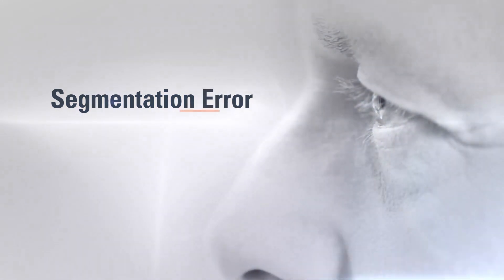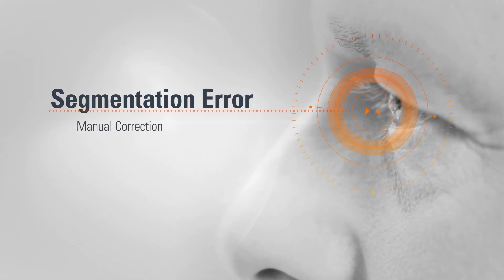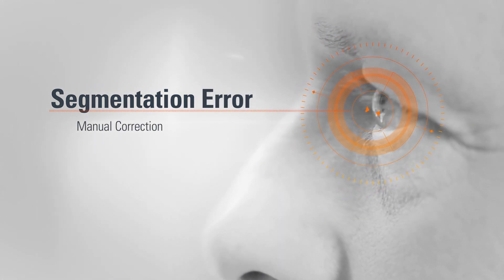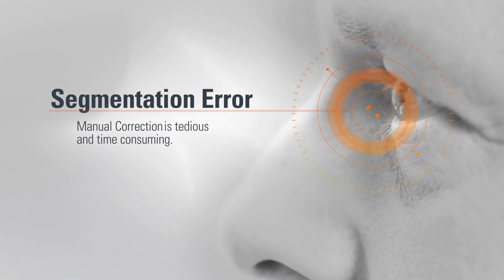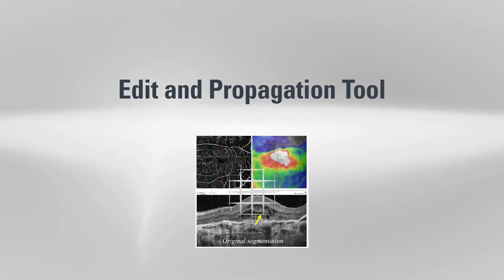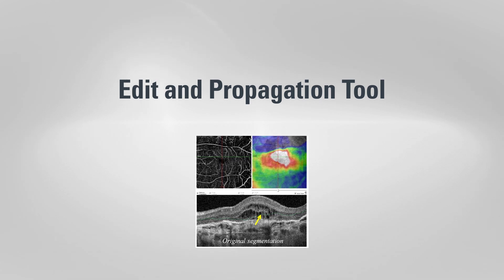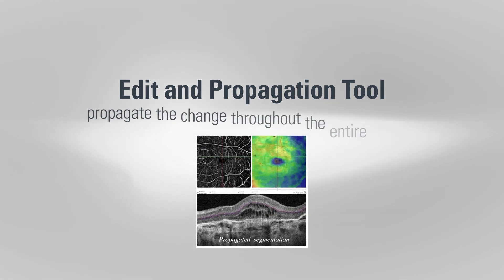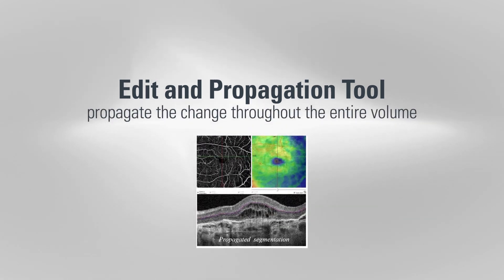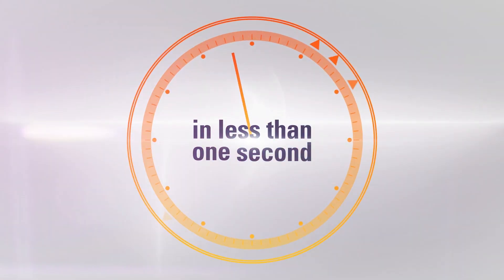Segmentation error is another challenge, but manual correction of this error B-scan by B-scan can be tedious and time consuming. With the new edit and propagation tool, users can quickly edit the segmentation in one B-scan and propagate the change throughout the entire volume in less than one second.